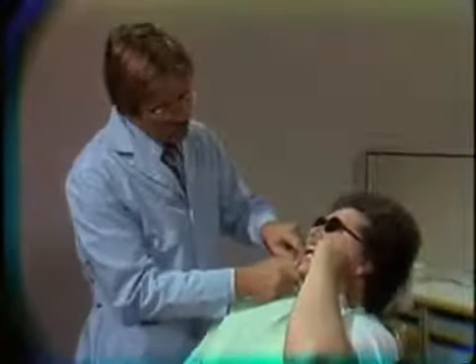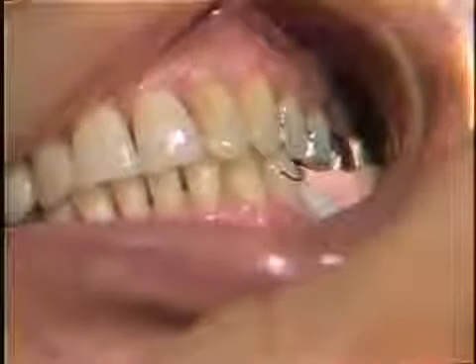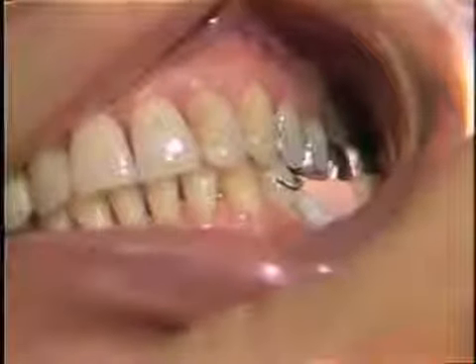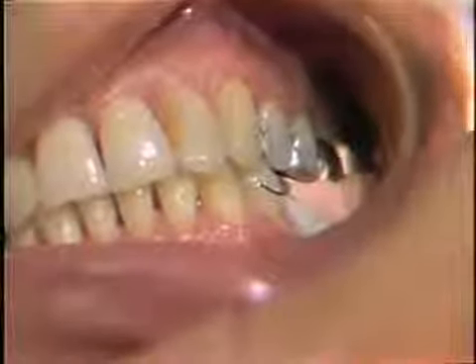Okay, and we'll have the patient then close into the centric occlusion position. The acrylic will take some time to set up, and it is exothermic, so we're going to allow some of the polymerization to take place, and then we'll remove it from the mouth and let it cool.